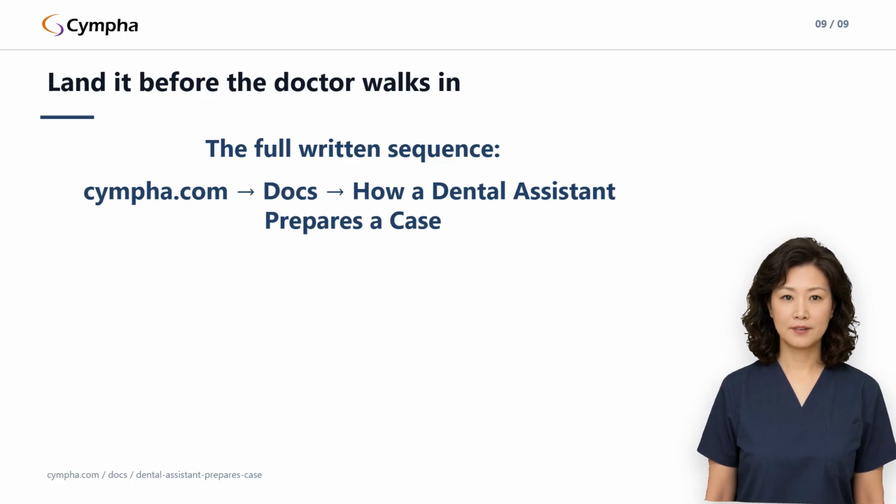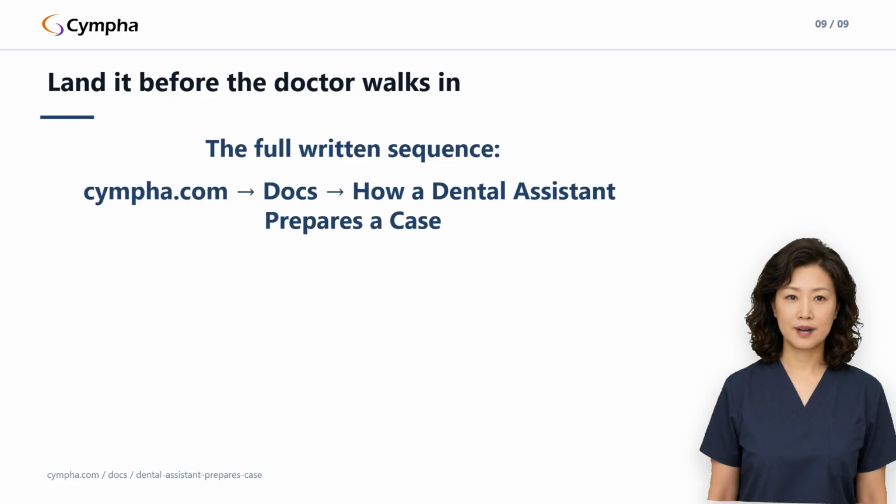The step-by-step written version lives at cympha.com. Open Docs and find how a dental assistant prepares a case, with the photo sequence and the tips laid out to share with your team.